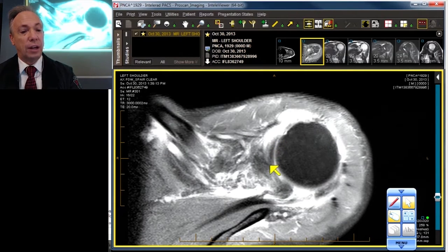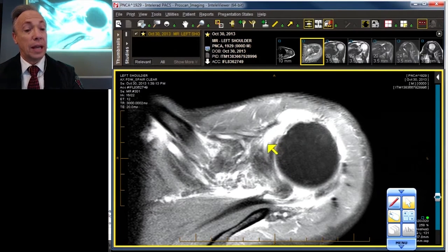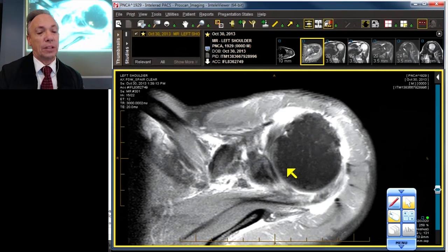Here's our biceps anchor coming in to the labrum. It forms very often — when you can see it with high quality imaging such as this — a V or a Y. The biceps can come in anteriorly and plug right into the tip, or it can parallel the labrum for a bit anteriorly, or it can come off in the mid, or it can come off in the back. There's quite a bit of variability in the takeoff of the biceps labral anchor.